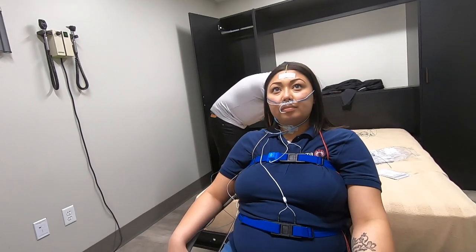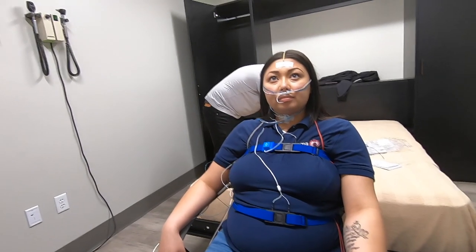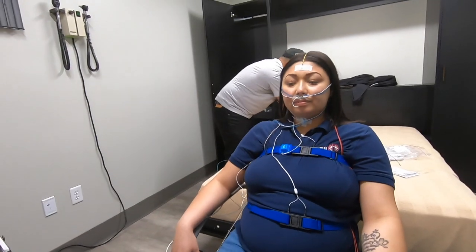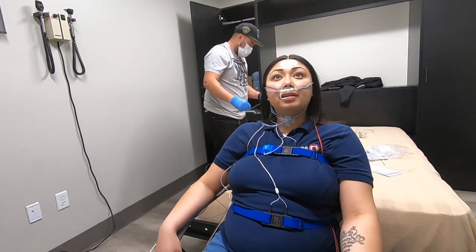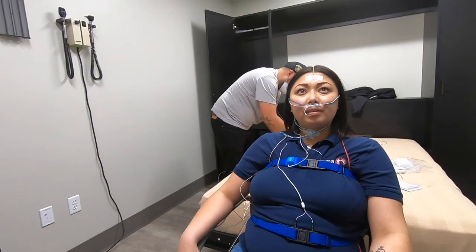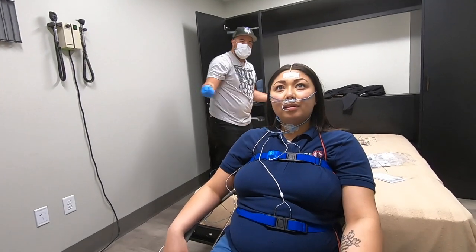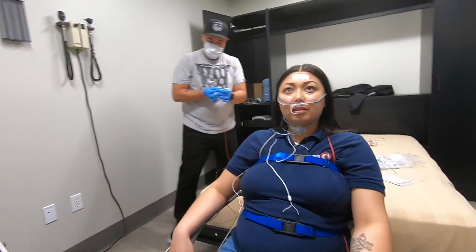That creates a place where those can disperse using the body as a ground. She has a lot of other electrodes, wires, and belts all over her. Some that you do not see right now are on the legs — a couple of electrodes attaching right there on the front of the shin, called the anterior tibialis. You have two placement points at the end of the leg, so it picks up things like leg movements. The wires are running up and exiting out the top of her shirt.